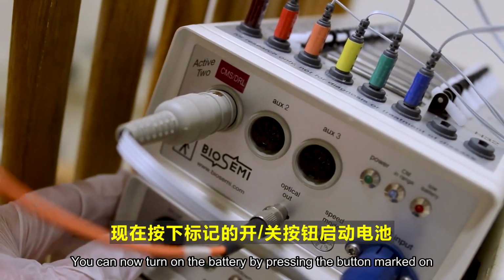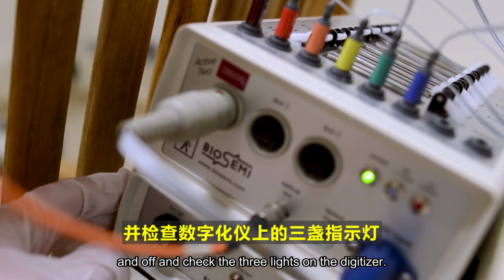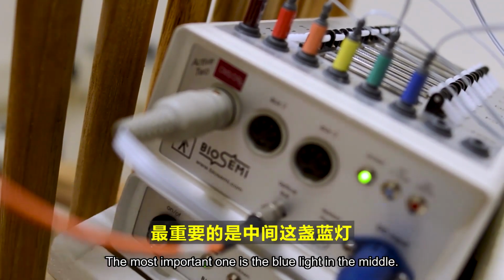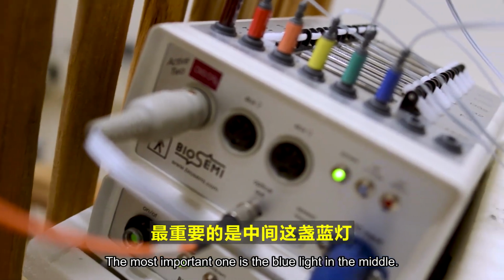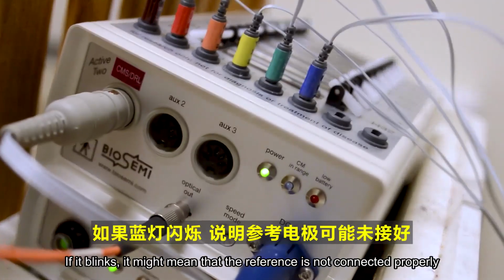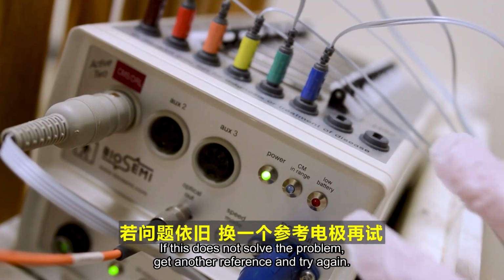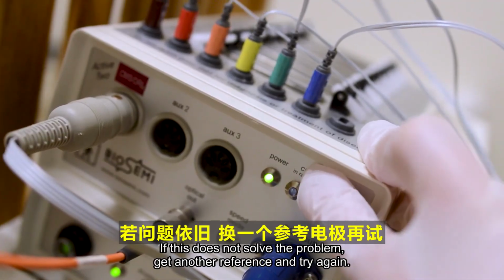You can now turn on the battery by pressing the button marked on and off and check the 3 lights on the digitizer. The most important one is the blue light in the middle. This should shine solid blue. If it blinks, it might mean that the reference is not connected properly, so take it out and repeat the gel insertion step. If this does not solve the problem, get another reference and try again.